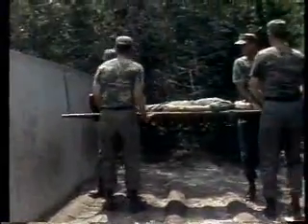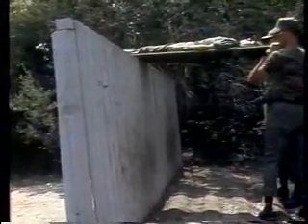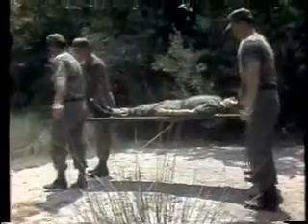A high wall can present a real problem to a litter team, or you may be trying to move a patient through a window in a wall. Here, using a little bit of a modification of the overhead carry, they move part of the patient over the wall. Note that they have the front stirrups over the wall to provide security for that litter patient. They will move the litter forward again, keeping the back stirrups, or the head of the patient, again on the opposite side of the wall to hold the patient. The team members move over in sequence and then lift the patient over the wall and carefully lower the patient down and continue on.